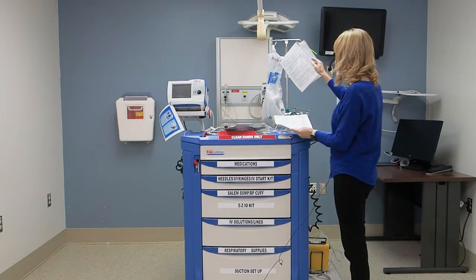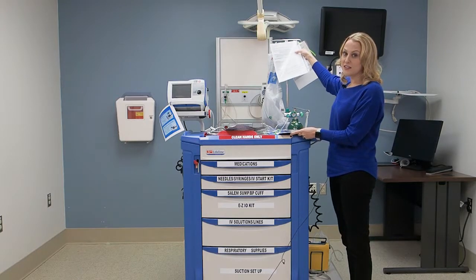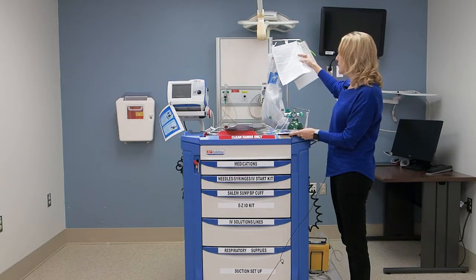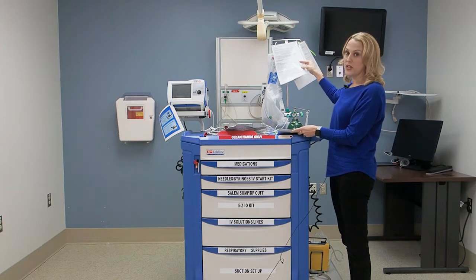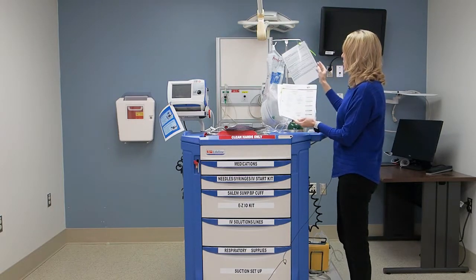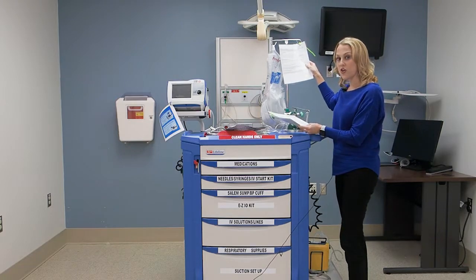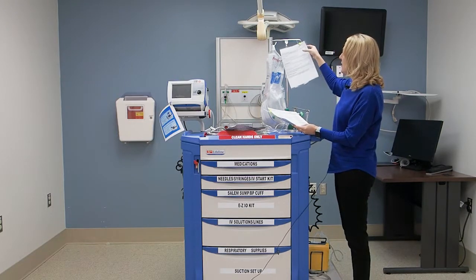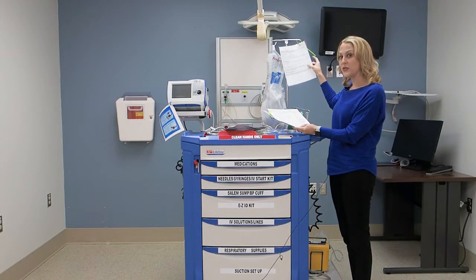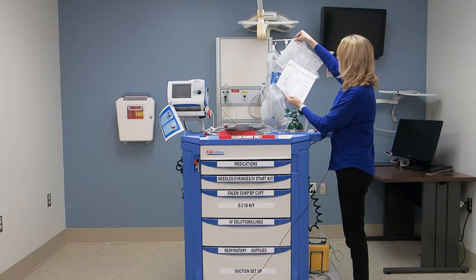Behind the algorithms, you're going to find a few other pieces of information. You're going to find a list that explains the daily check of the defibrillator and then also the weekly check of the defibrillator. Located behind that, you are going to find instructions on how to clean the crash cart after it has been used. It explains the entire process, what you need to do, and who you need to call if a crash cart has been used.